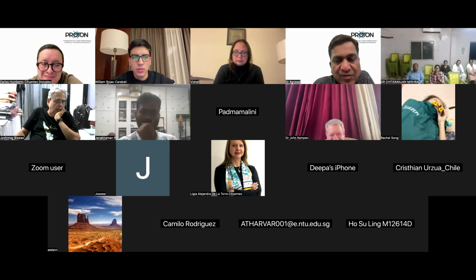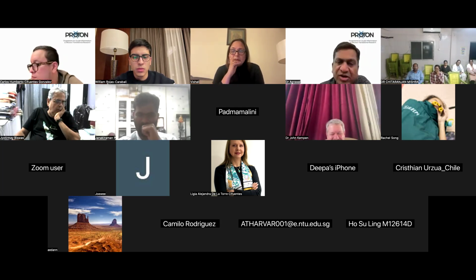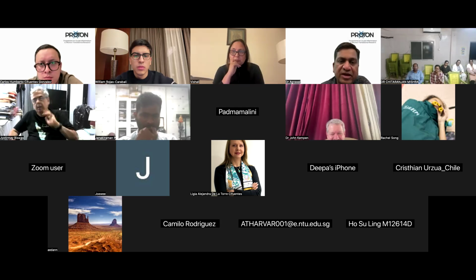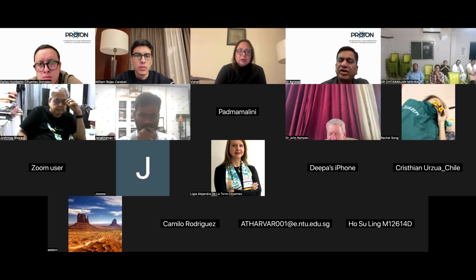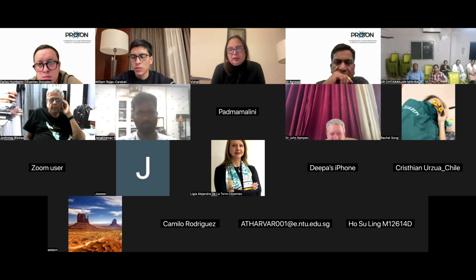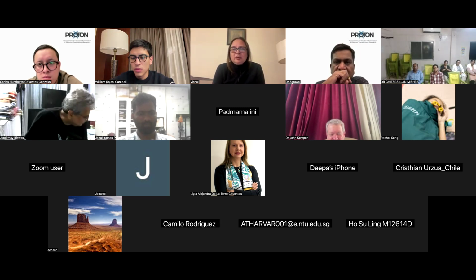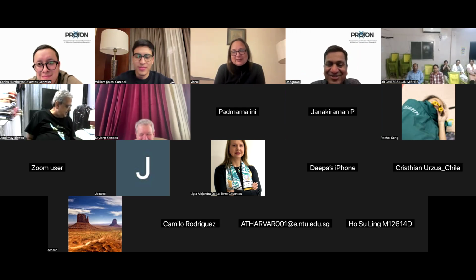Yeah, I've been trying to arrange that Remidio wide field. I don't know whether they have come out with that. Dr. Vishali, I don't know whether you know about that. Remidio is trying to come out with wide angle imaging, at least the fundus camera. Waiting for it. We don't spend money from our own pockets, so we buy. No, we are trying to get one for John there in the center, but we'll see how it goes.